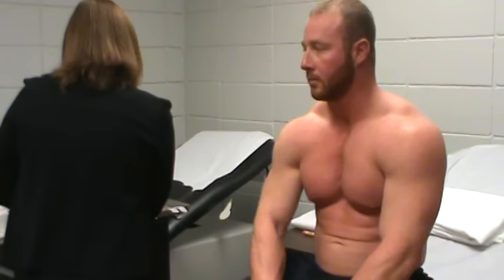Okay. All right. Okay, Brian, next thing that we want to do is we're going to look at your thorax. So we want to listen to your lungs. I want to make sure that I don't hear any kind of fluid. Do you have any respiratory problems at all? No. Do you smoke? No. Outstanding. All right. So I'm going to get you to stand up for me.